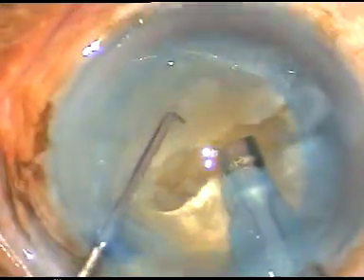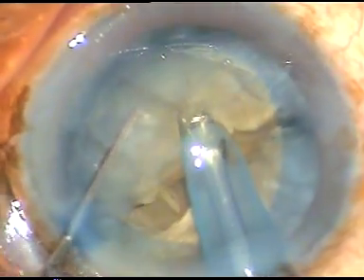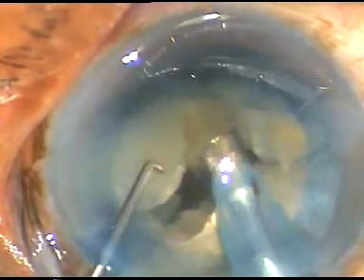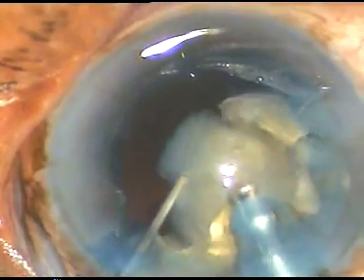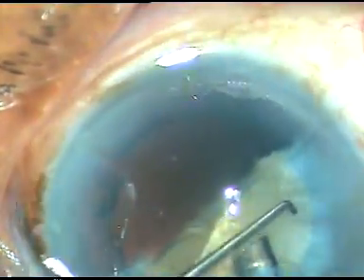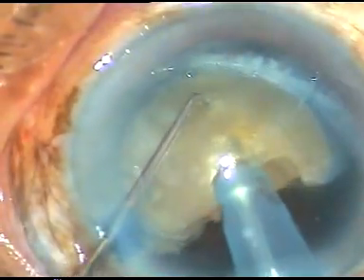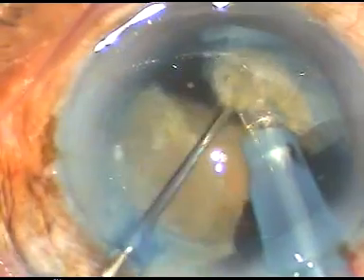In this case, the nucleus has been divided into two heminuclei by this time. Now each heminucleus is then further subdivided into two parts, and each part is then emulsified with ultrasonic energy. Phaco power used in this case is 75%. Flow rate is 45 ml per minute, and vacuum is 450 millimeter of mercury.